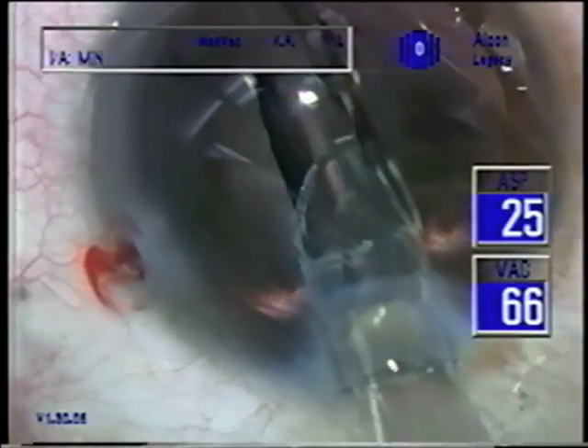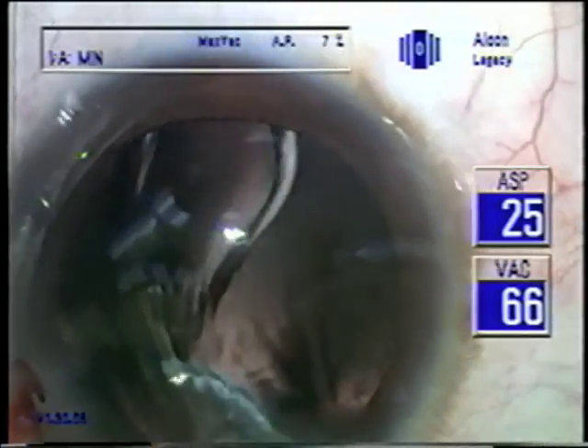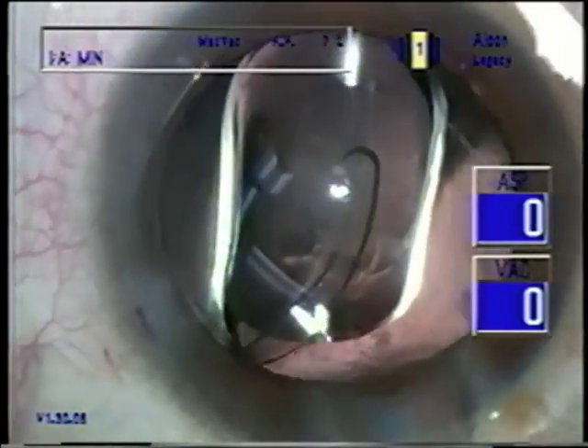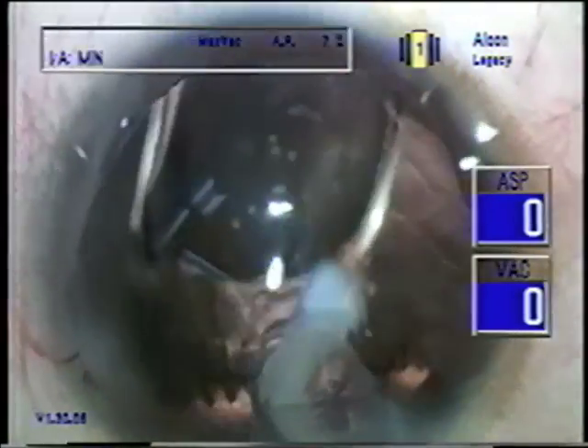See, we didn't have to enlarge the incision. This is the single-piece SA-60. It's a full 6-millimeter optic through an unenlarged phaco incision. And we've put the elbow under the capsule so that as it unfolds, you can use the I-A tip to speed up the unfolding.